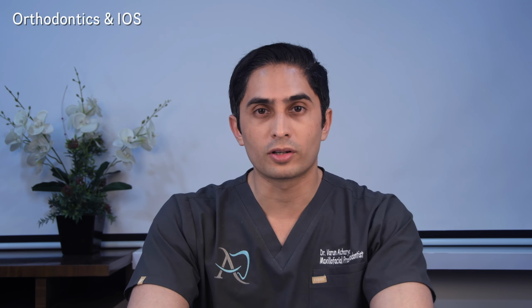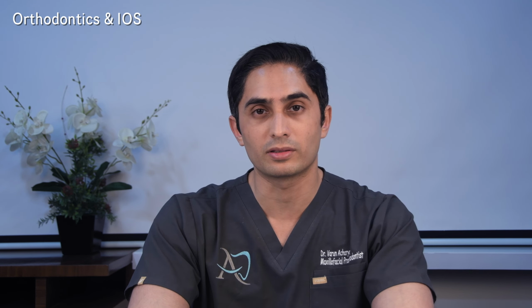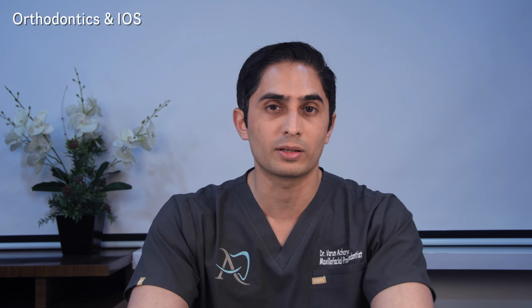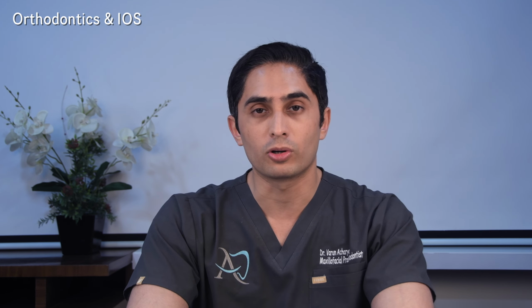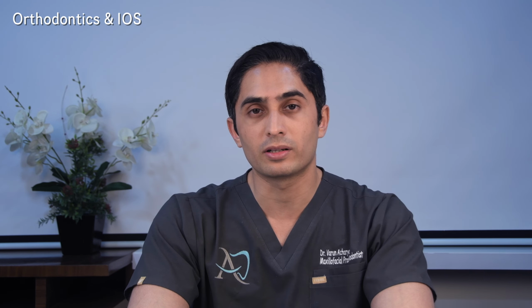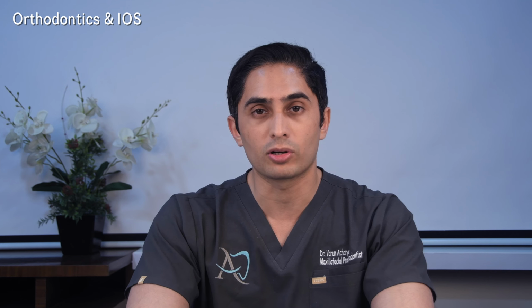Now, if you're an orthodontist, of course you need to buy an intraoral scanner because a lot of orthodontic movements now are happening with aligner technology, and intraoral scanners are the way to do it. I think using PVS impressions for orthodontic cases is wasteful, and I think you're going to actually get much better results with using an intraoral scanner to plan your aligner cases.